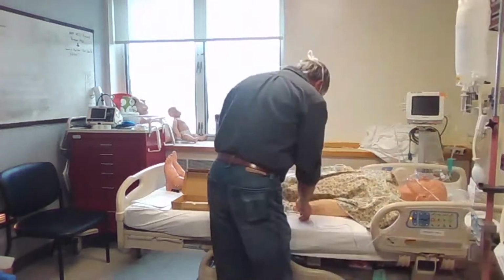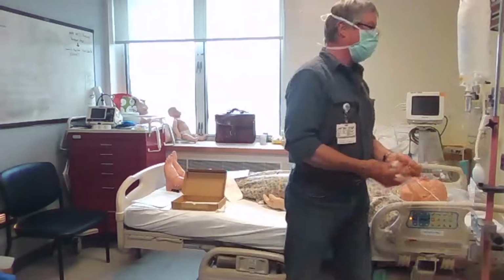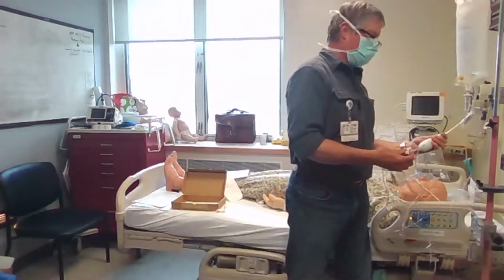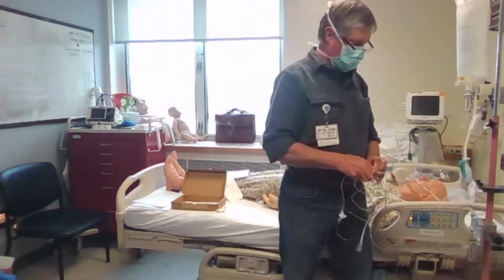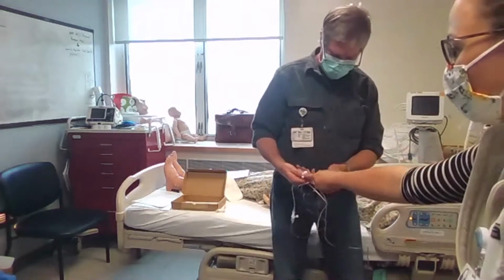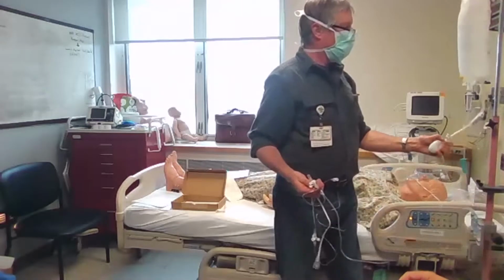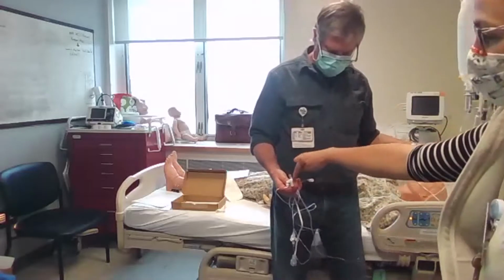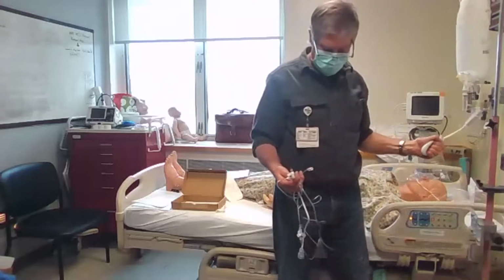Is the stopcock off at the bottom? Yes, thank you. So now I'm gonna take it down, because now it's gonna shoot all over us. Remember the stopcock, wherever the prong on the stopcock is, it's off to that end. Off to where it's pointing. So for this one, he was trying to get it to prime, but this is a continuous line, so it has to be off to the sample port. Yeah, and it was off.